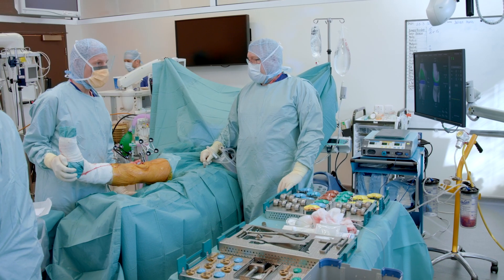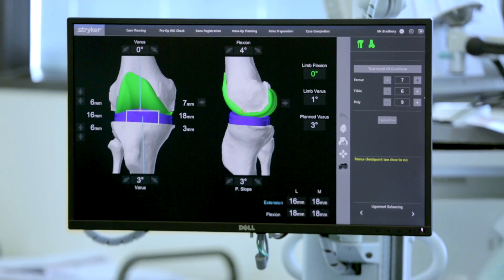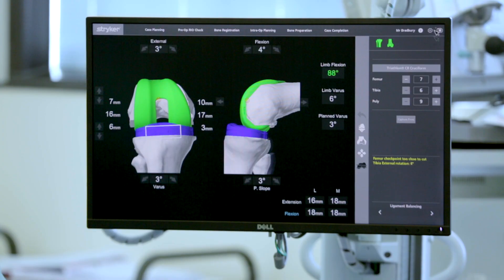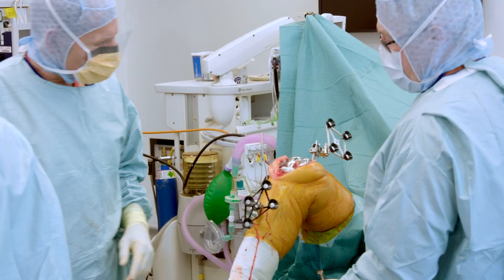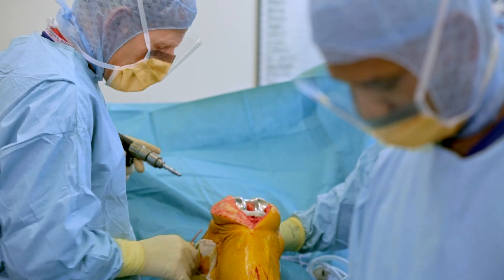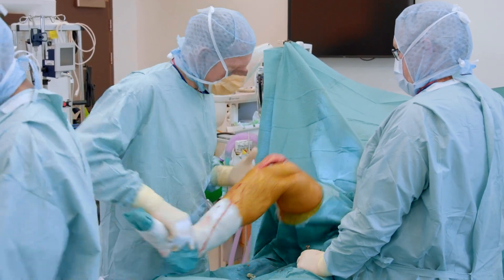With the final implants in place, we have straightened the knee completely. We now have a knee that has been resurfaced in a perfect position, we've had to do no ligamentous releases, and this gentleman should have a great recovery. Robotic surgery has been used for some time now in different fields in medicine — the whole aim is to use technology to help us personalise what we do for individual patients, to plan what we do and carry it out accurately. It's part of a general trend to ensure that medicine is personalised for the particular individual patient in front of you.